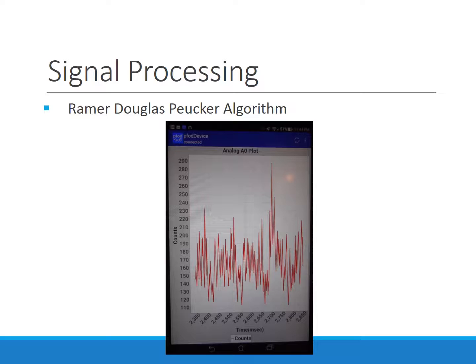The Ramer-Douglas-Peucker algorithm was more precise than the exponential moving average filter. This filter did show signs of periodicity and occasionally captured the maxima that the data contained. However, there was not a consistent output of sinus rhythm, making this not the best choice.